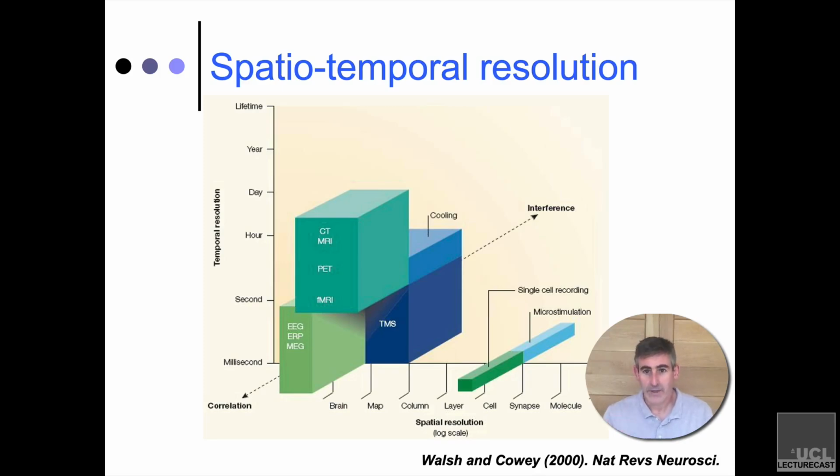So one of the important limitations then of fMRI is the temporal resolution, right? I've suggested that it's pretty good on spatial resolution, particularly for structural imaging. For functional imaging, that's true, but it requires fancier devices. For instance, the 1.5 and 3T scanners that we have down in Buckney are pretty good up to maybe a 2 by 2 by 2 millimeter resolution.